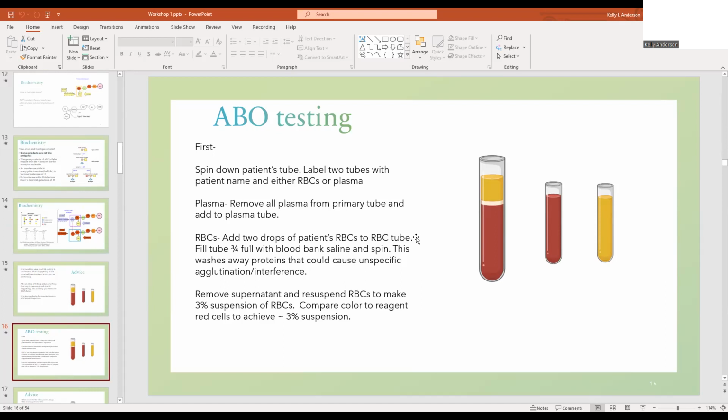This is the check digit. There's a calculation that adds all these together and then shoots out a check digit. Some donor centers do not use the check digit either, they just use this number. But basically, these are meaningful. These will be unique. So on your paperwork, when you're working with a donor tube, you can use this part of the DIN flag as your patient ID or your donor ID.